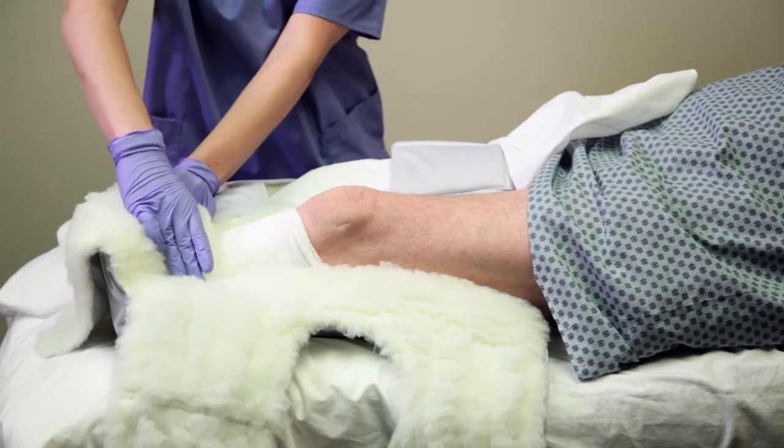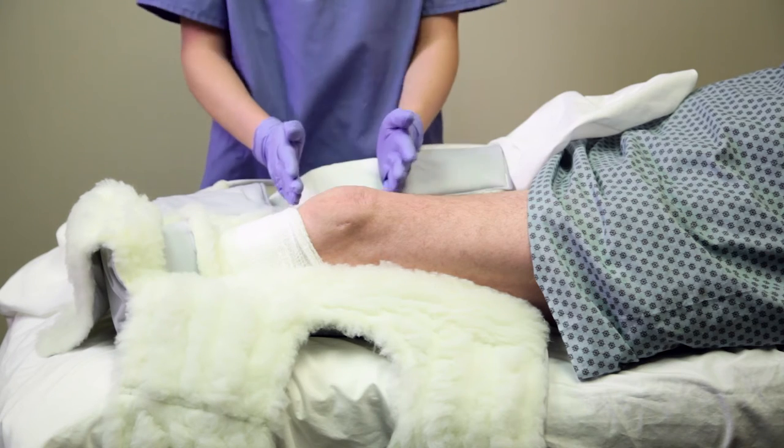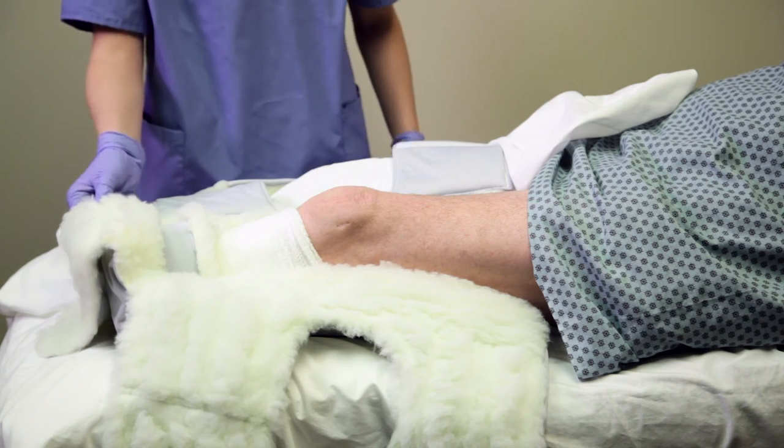Generally one or none of the spacers is enough to orient the patella in the correct location, but a second is provided for patients with a particularly short residual limb.